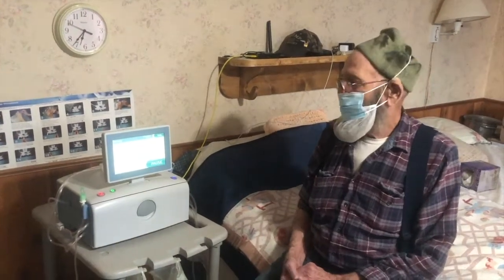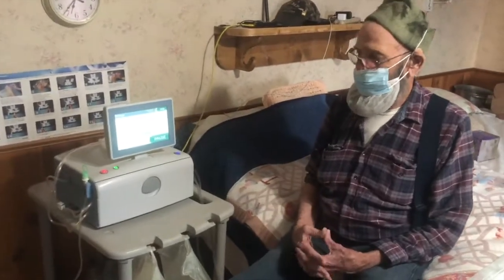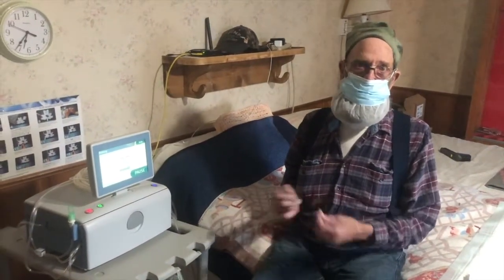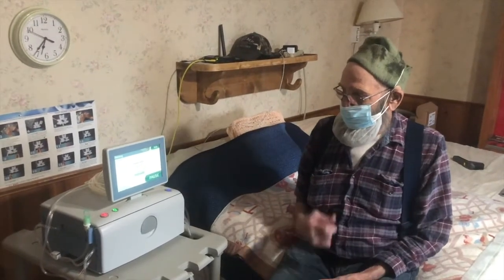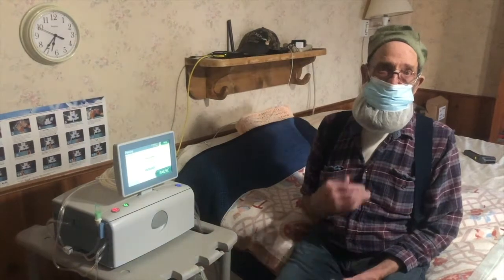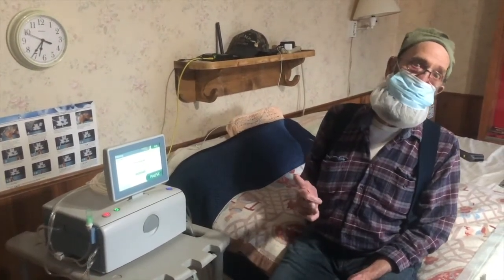Like I said, this machine is miraculous compared to the other one that we had. I like this one a lot better. It's a lot gentler on the transfers. I do have to rock quite a bit at night when I'm doing those pump offs to get most of that stuff out, because my torso is longer than most people's torso. That's what they tell me.